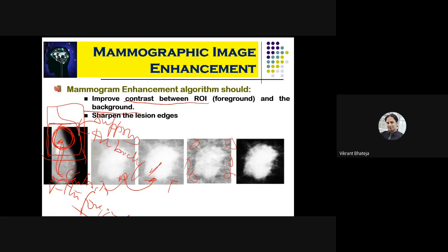But if you see this last image, I have not improved the contrast much. The contrast was white and some part of the whiteness is increased, but rather than increasing the contrast or whiteness of the foreground, what we have done is suppress the background. It is the suppression of the background that has made the sharpness increase.